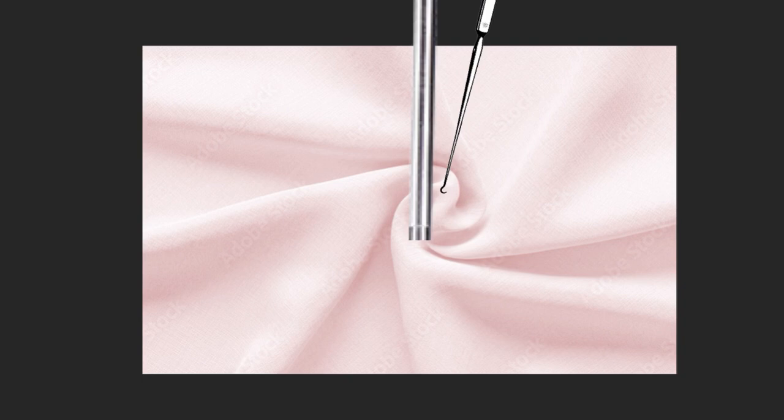I forgot to take a close-up picture of that when I was doing the demo in the department, but just to sort of give you an idea, this is what you're doing. You're just twisting that skin against the edge of the needle, and it just makes a nice tight seal. You may have realized that this is actually a very good technique for doing superficial lesions, even in a thicker breast.